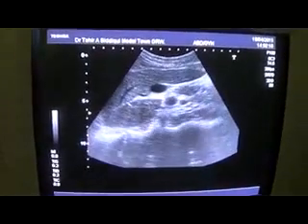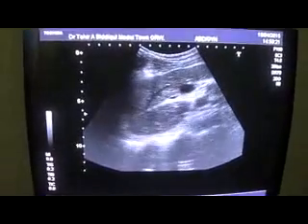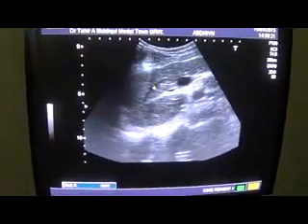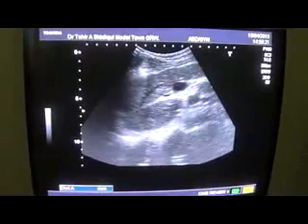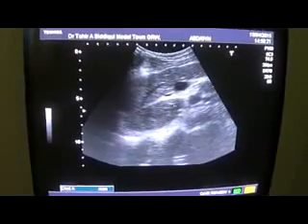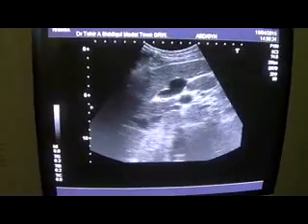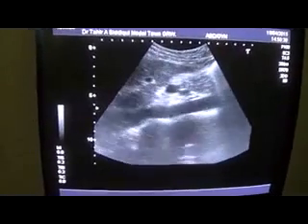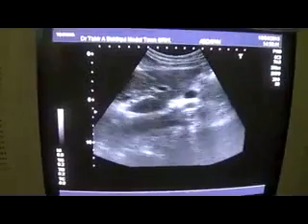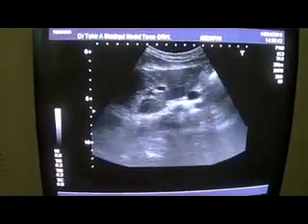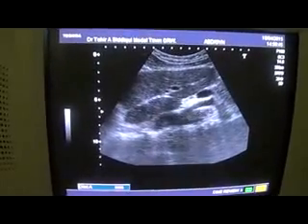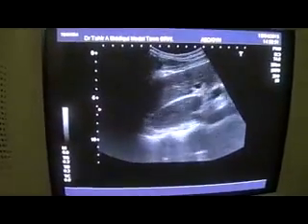This is the left lobe of the liver, showing the left hepatic vein, and this is the ligamentum venosum — the curvilinear structure in front of you. This is the aorta, and this is the superior mesenteric artery arising from the aorta. There is no adenopathy seen in this region.